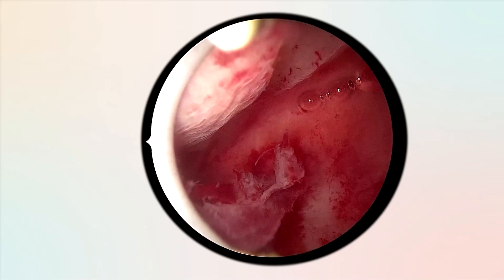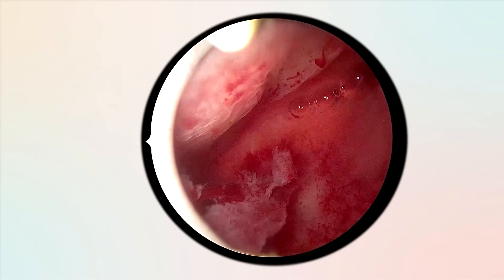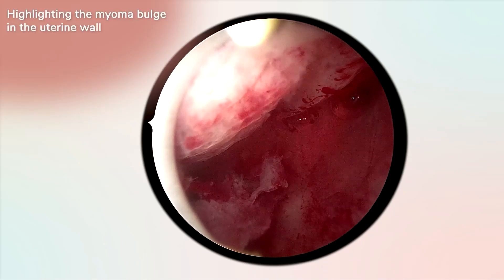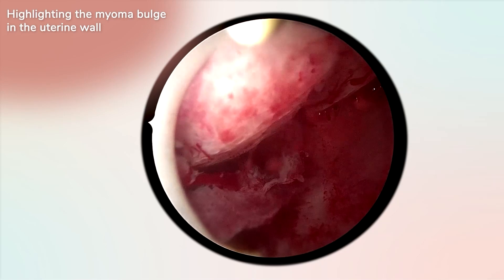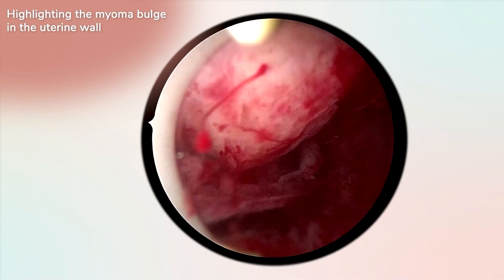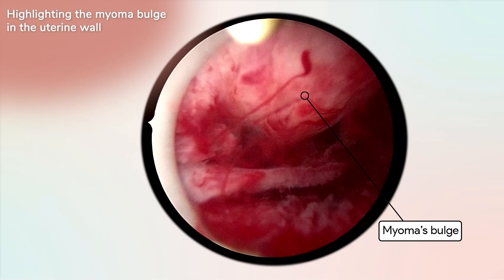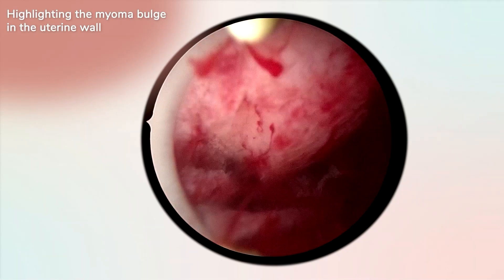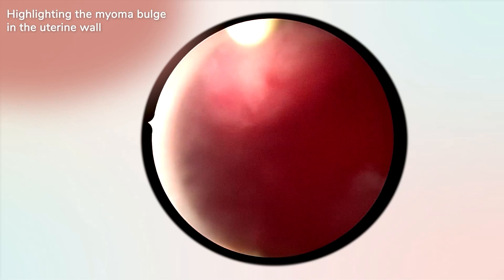The procedure is performed in the operating room under general anesthesia, following cervical dilation with Hegar dilators up to size 10. A 26 French monopolar resectoscope is introduced in the uterine cavity. The inflow pressure distends the uterine cavity, creating the illusion of the absence of a myoma.